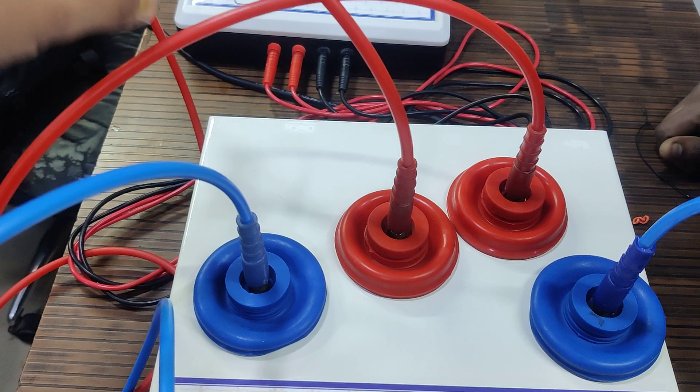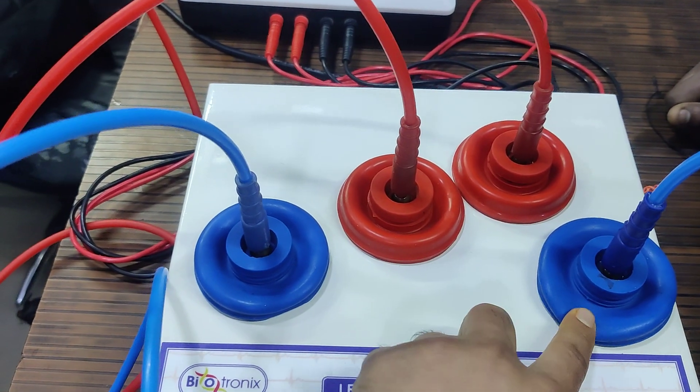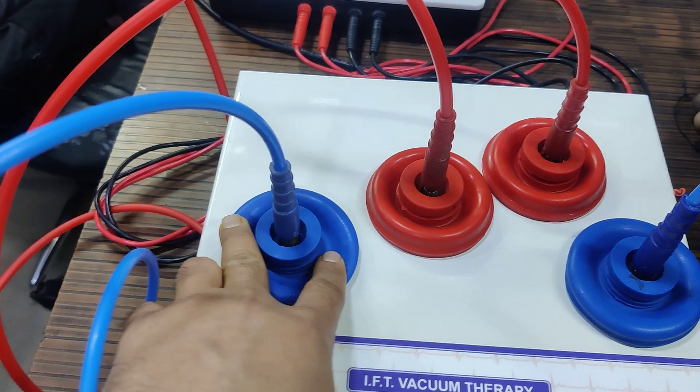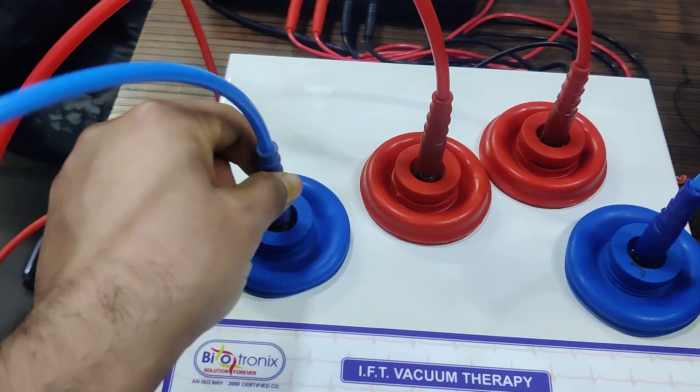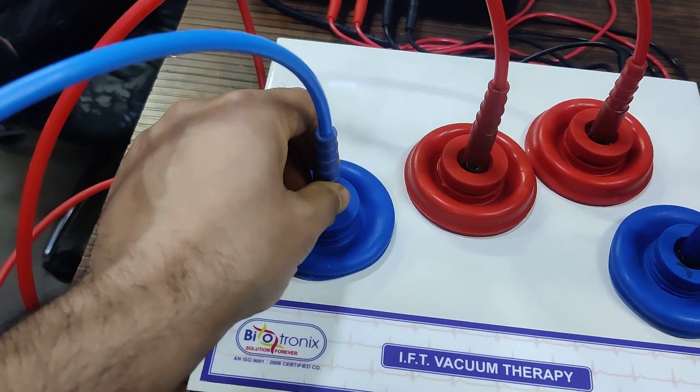When I put the intensity over there, the same will be felt here. The IFT output will be felt here and the vacuum will also be there. This is the vacuum. This will stick to the patient's surface, patient's skin.